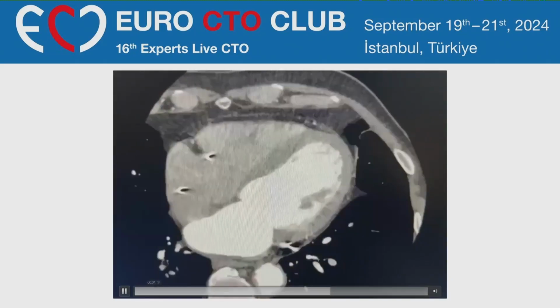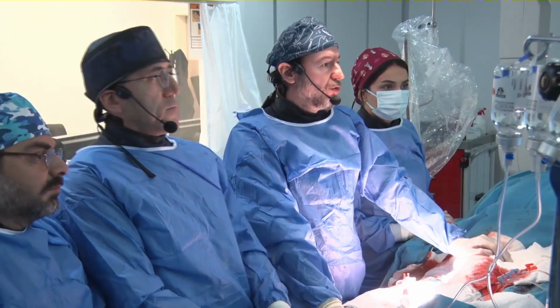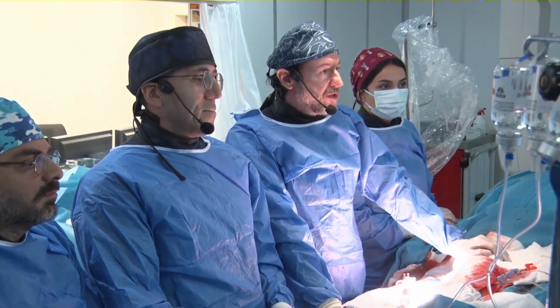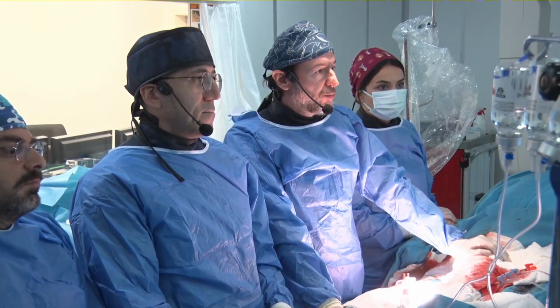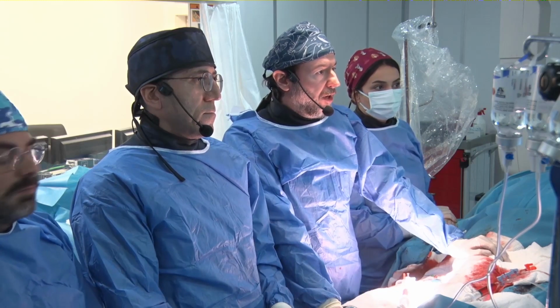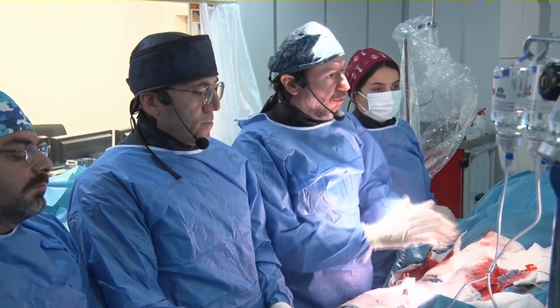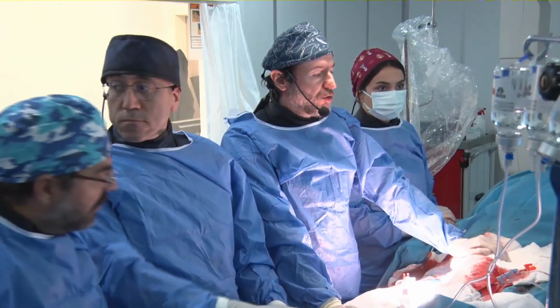Guys, can you hear me? So the problem with this case is, this is an ostial CTO. I hate ostial CTOs because you need antegrade vessel preparation, and without antegrade vessel preparation, your chance is only just tossing a coin into the air and hoping that you have the right answer. So therefore, I need your guidance here. We have a CT angio, but the CT angio doesn't help us much.